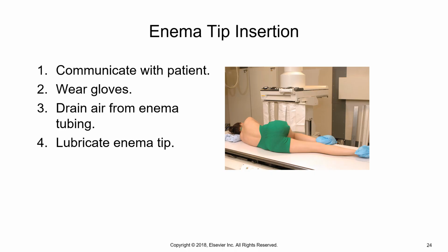When the enema tip is going to be inserted, remember you should have already tested that tip to make sure that it's functional. You're going to want to talk to your patient because they usually are very apprehensive on this part. Gloves, I usually tell you to put 2 pairs of gloves on. It's very hard to put gloves on once you've had a pair on and take them off. So if you have 2 pair on to begin with, then it's easier once you tip the patient. You just take off your top pair of gloves and throw those away, and then you're good to go with the other pair already on.